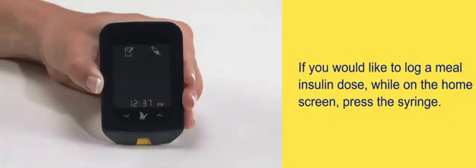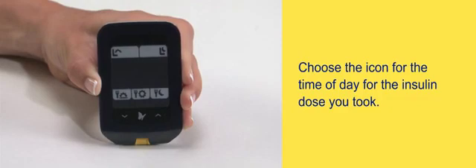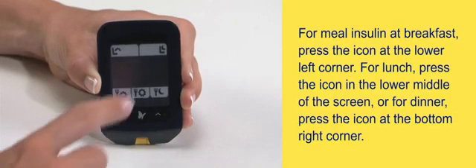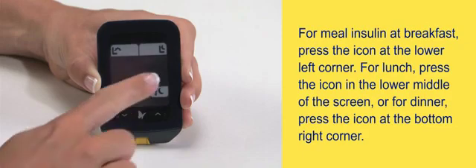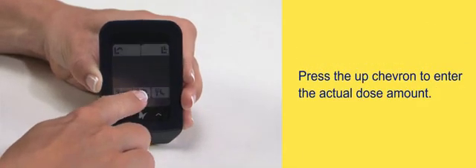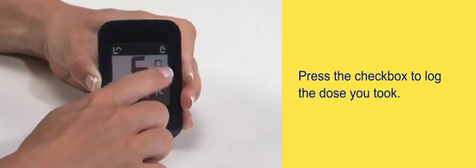If you would like to log a meal insulin dose, while on the home screen, press the syringe. Choose the icon for the time of day for the insulin dose you took. For meal insulin at breakfast, press the icon at the lower left corner. For lunch, press the icon in the lower middle of the screen. For dinner, press the icon at the bottom right corner. Press the up chevron to enter the actual dose amount, then press the checkbox to log the dose.